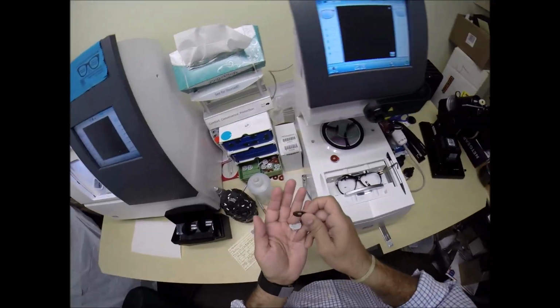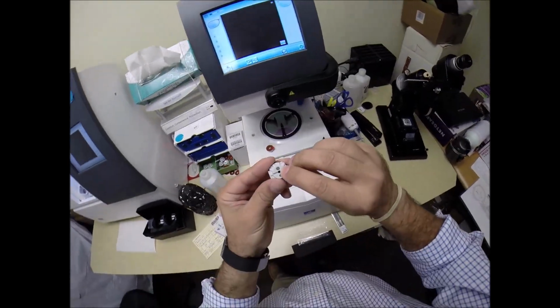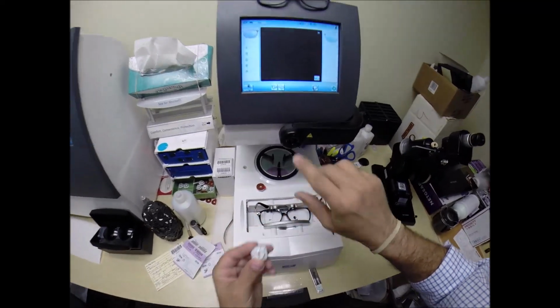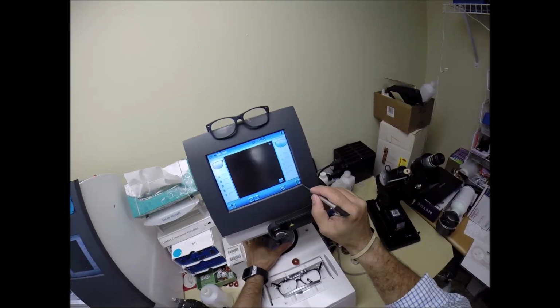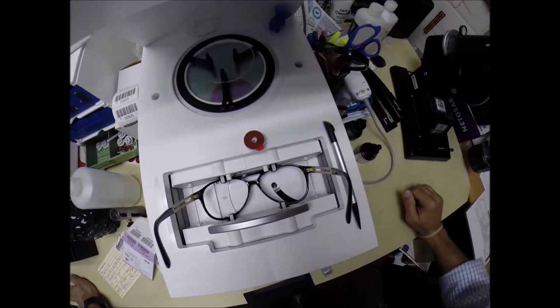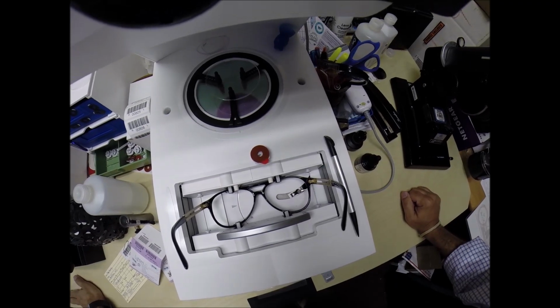It was alive. It wanted to get away. It jumped back into the ocean. Put the sticker on there. Now on the back is a little magnet. It's going to do its job twice today. The first time it's going to attach itself to another magnet there in the arm. Let's pull that off. Place that in there. I'm going to line, well actually I got to hit trace. A little stylus is going to pop up and go around and trace the inside bevel of the right side of the frame before doing the same thing on the left.